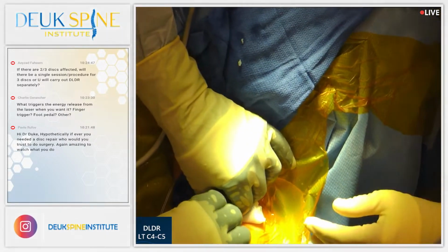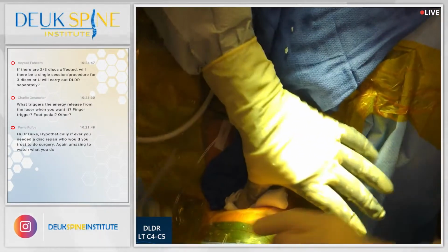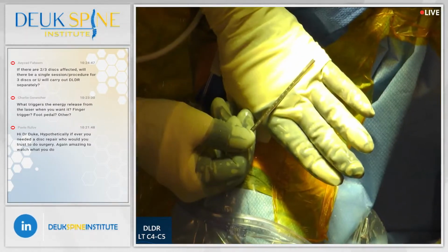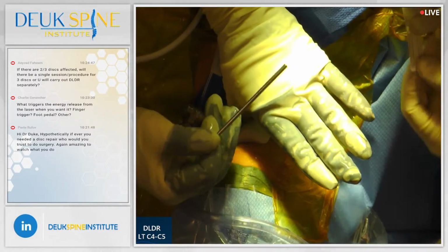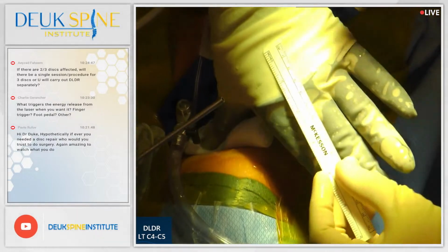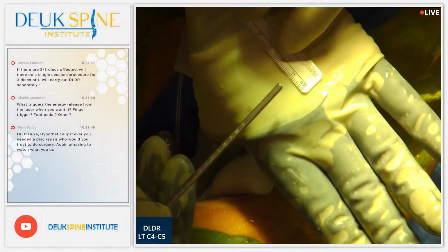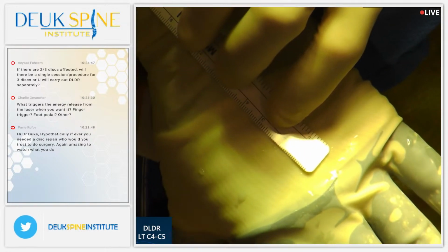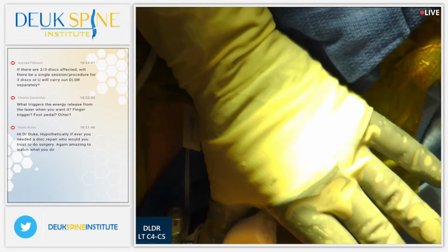Check this out, folks. By the way, Luis already sent, okay, I want to show you a few things. One, look at this tube. This tube is the tube I did the whole surgery through. See how small it is? 4 millimeters. Other way. Yep. 4 millimeters. You guys see that? Yes, we do.